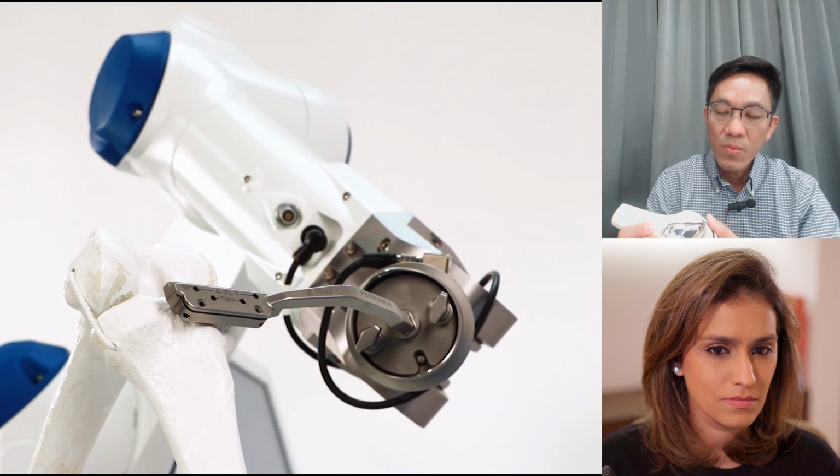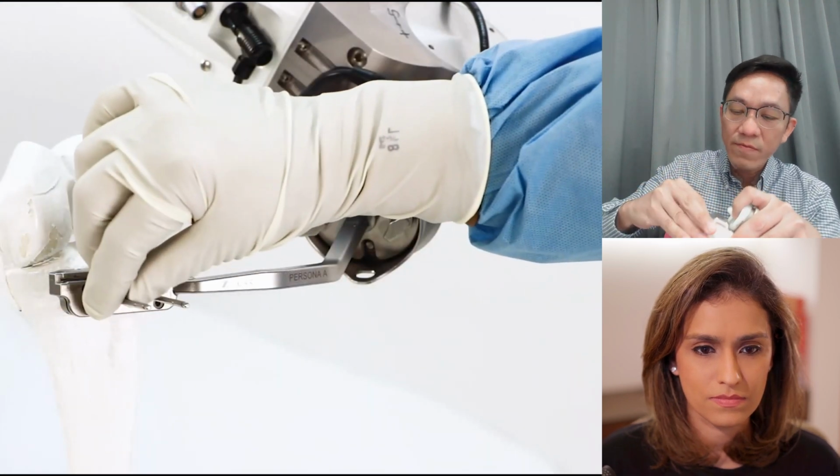In a knee replacement, what actually happens is that you need to perform several bony cuts to implant the knee replacement, which is made up of very simple components: a metal cap, a tibial base plate, and a plastic polyethylene. What the robot system does is calculate all the parameters required to make the bony cuts in an accurate and consistent manner, such that we can deliver sub millimeter and sub degree accuracy of a straight knee that has good range of motion, full extension, and full flexion, and is naturally balanced. This allows us to deliver on the promise of a painless, very flexible knee that is also natural feeling to the patient.